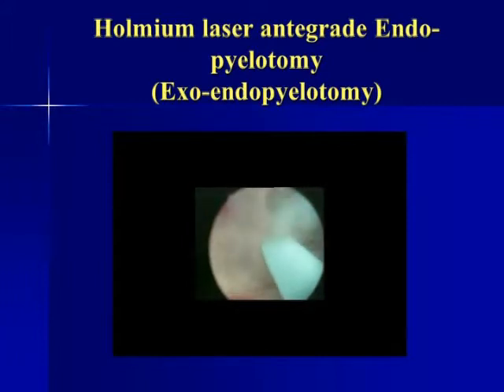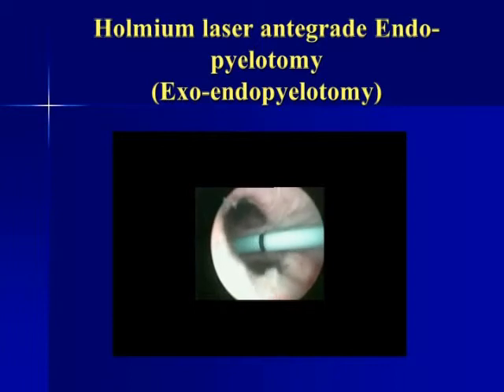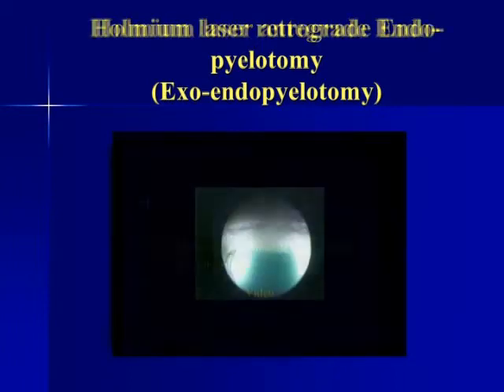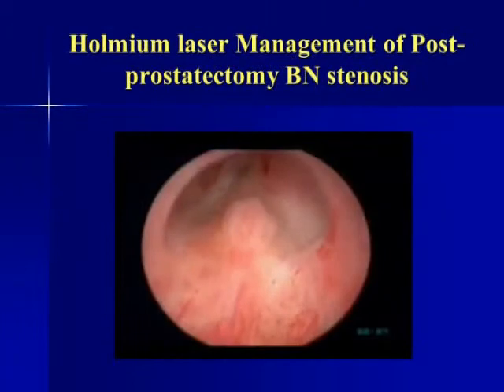Once a proper adequate cut is made, then again we switch over to a nephroscope and put an endopyelotomy stent across this incised PUJ under visual guidance using a nephroscope. The same thing can be done from below, either with a rigid or flexible ureteroscope. I will split this movie.